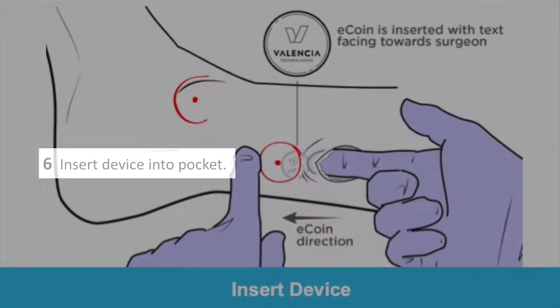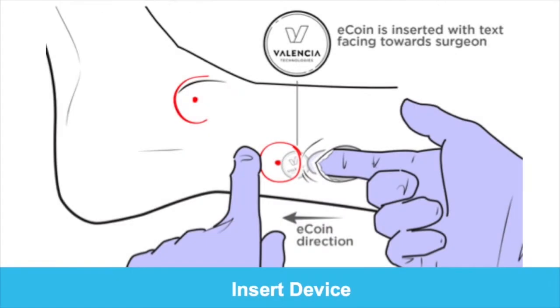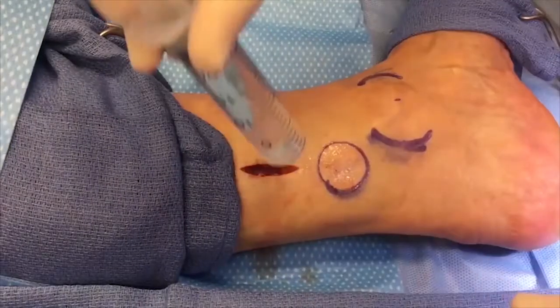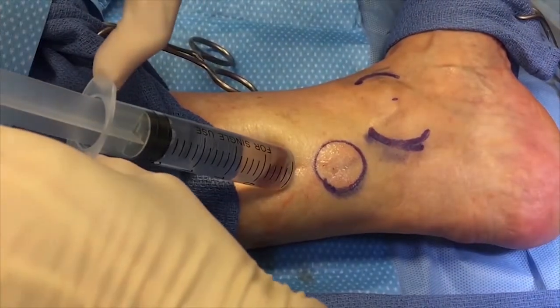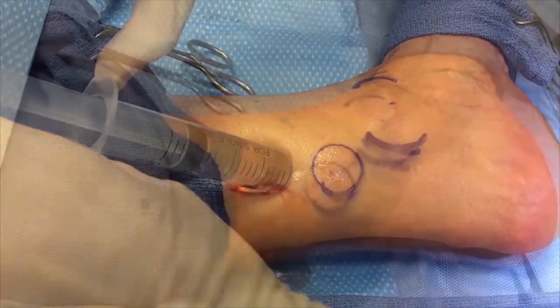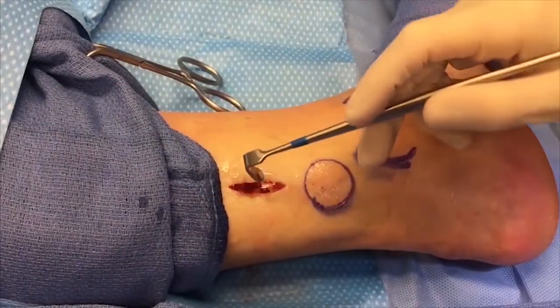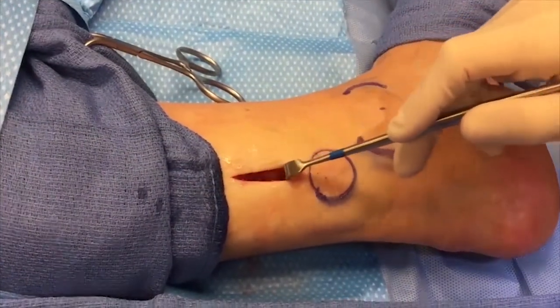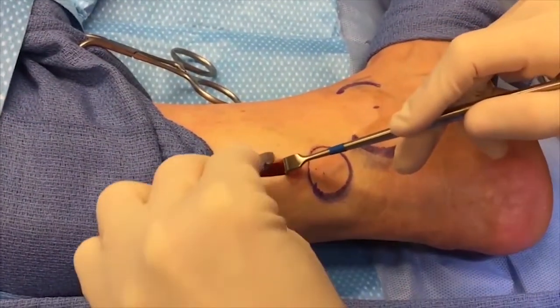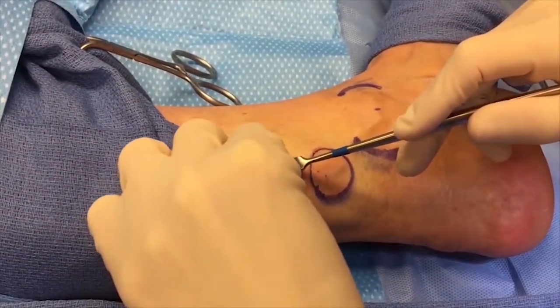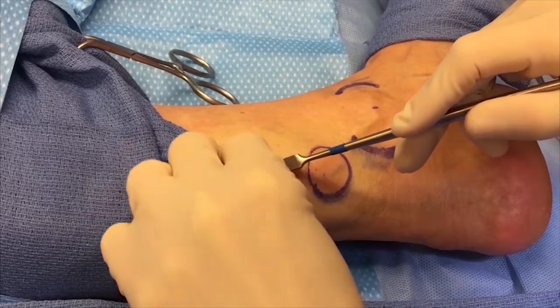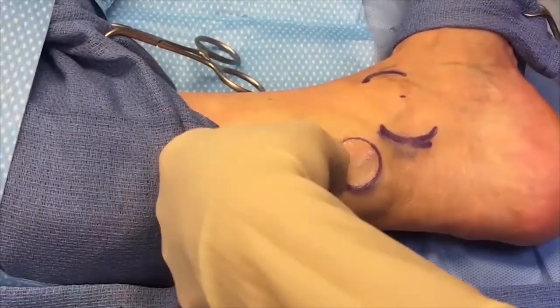Step 6: Insert Device Into Pocket. The device is removed from its packaging in sterile fashion. Generously irrigate the pocket with normal saline. Insert the device and manually slide it caudally on top of the fascia until centered at the marked circle.